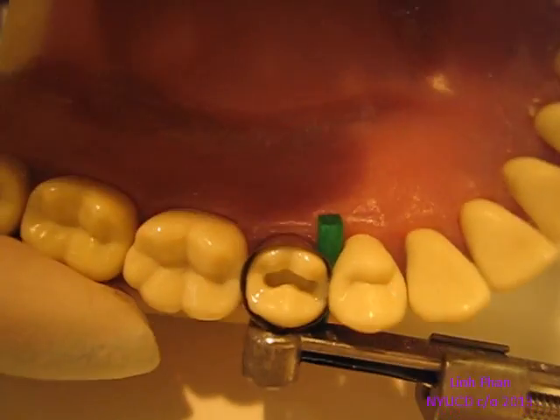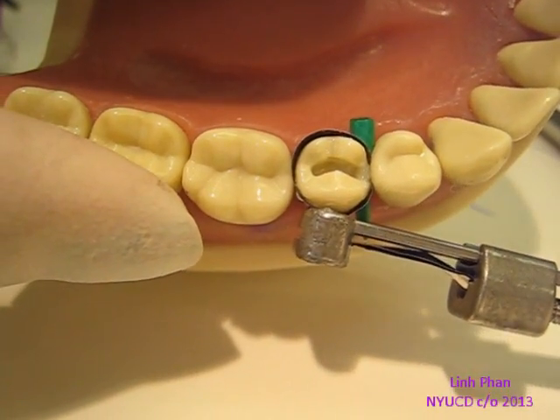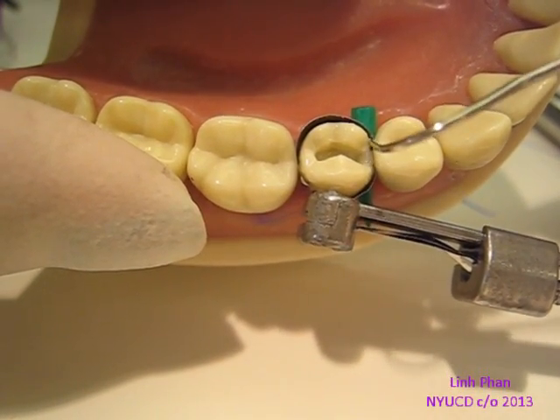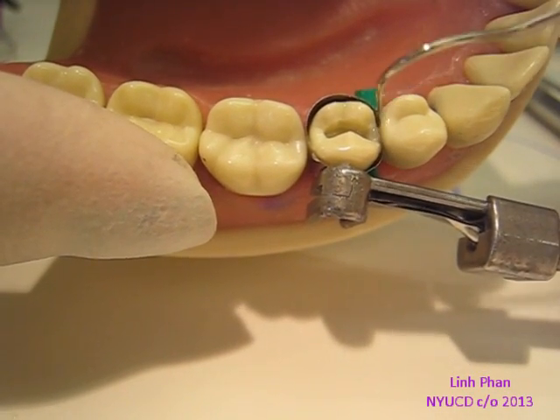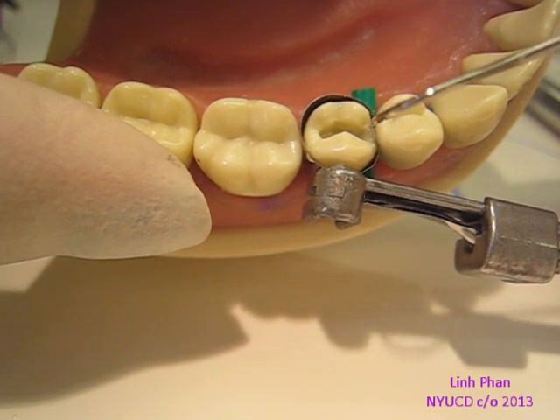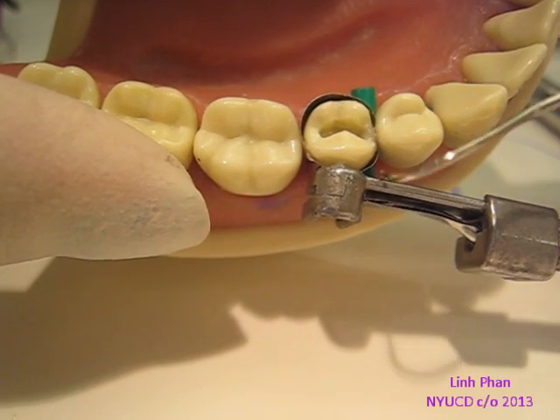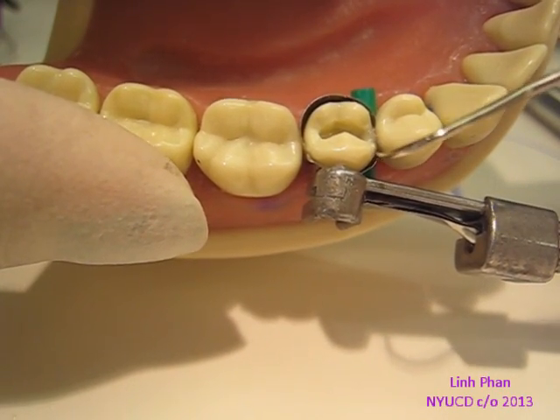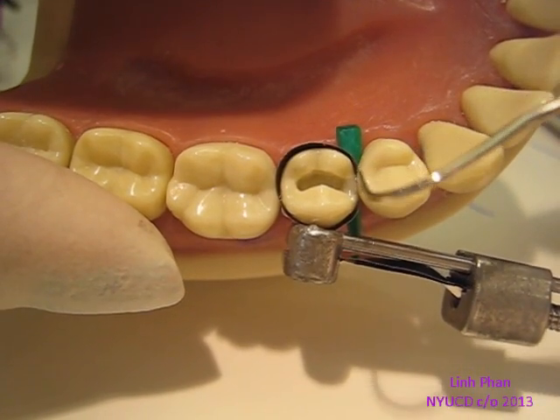Now that we have our marginal ridge, you can always go back with an instrument to make sure it's cured all the way. Check to make sure there's no gaps or it's catching anywhere. And if it is, then you need to add a little more composite. We pretty much have our marginal ridge as a nice shape, and you can keep going.